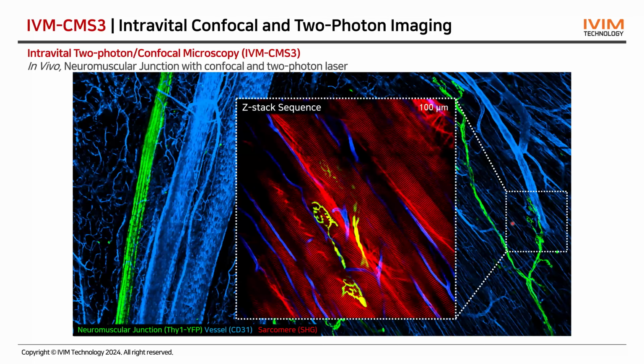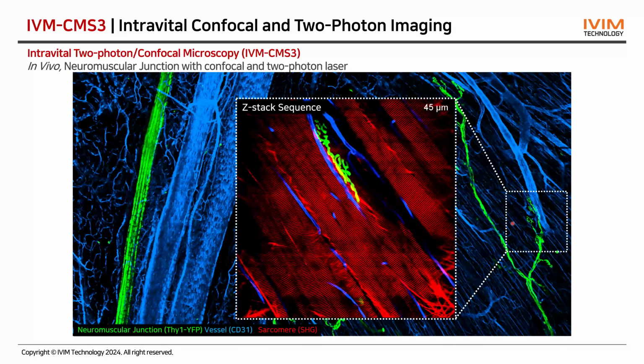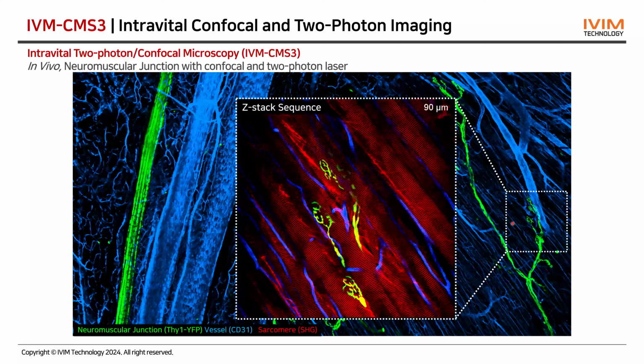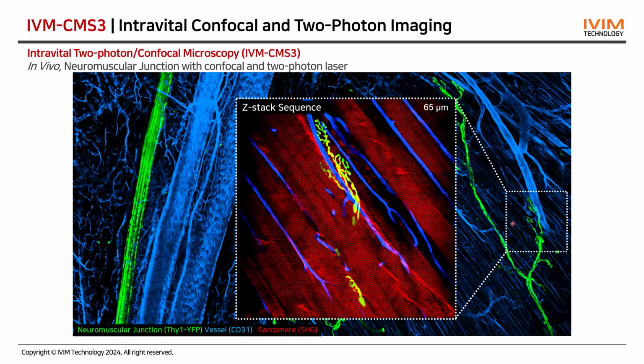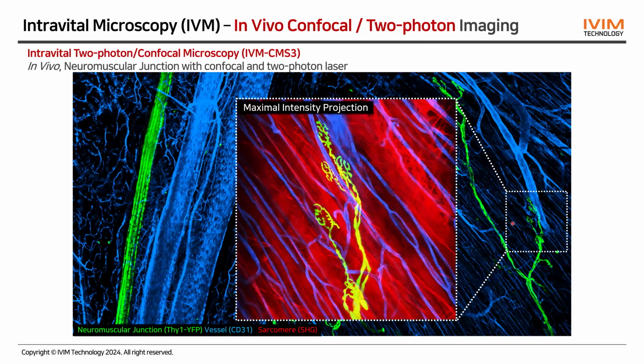But with the two-photon laser, we could visualize the actin-myosin structure in muscle with second harmonic generation signal, which needs no separate labeling. So if your research needs to see the accumulation of fiber, collagen, or muscular structure, the two-photon laser would be the perfect choice.